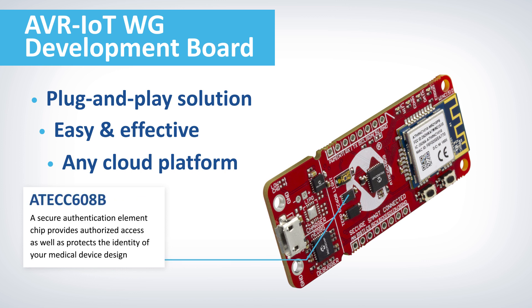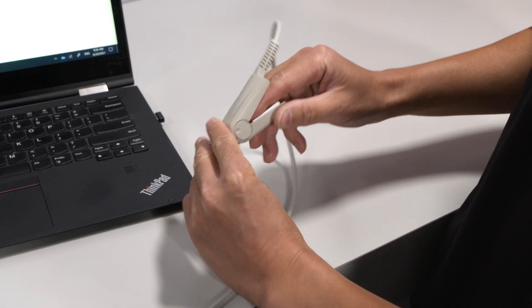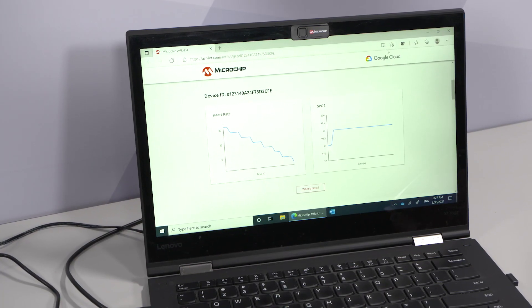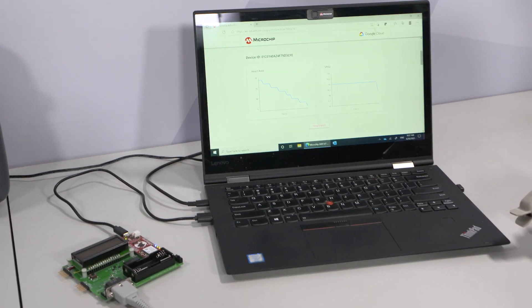Finally, a secure authentication element chip, such as the AT-ECC-608B, provides authorized access to the cloud platform of your choice, as well as protects the identity of your medical device design. As you can see, we have authenticated and are securely connected to the cloud platform. The cloud server is successfully receiving heart rate and blood oxygen vital signs from the Pulse Oximeter demo.